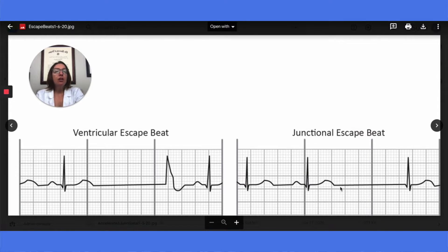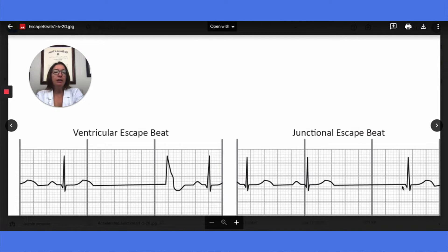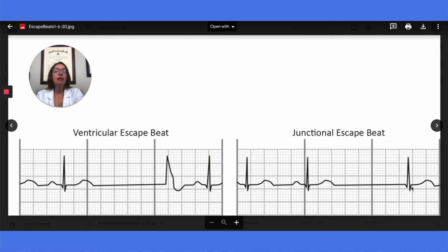With a junctional escape beat, this is initiated in the junctional foci, which is at the AV junction, and it causes the P wave following a pause to either be absent, inverted, or it causes an abnormally short PR interval. In this case, we just have an absent P wave, and the QRS complex will be of normal duration. For asymptomatic patients with escape beats, treatment is not typically required.